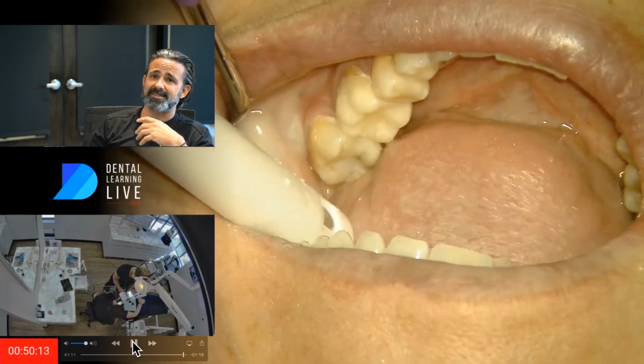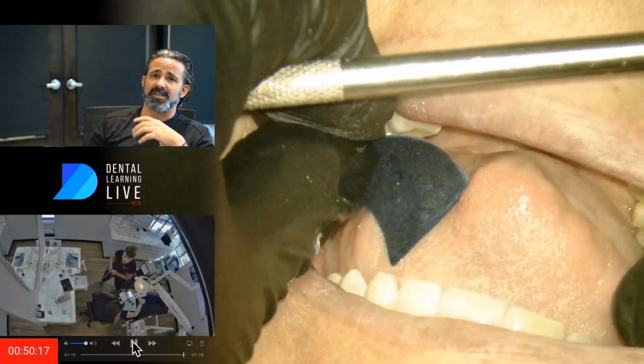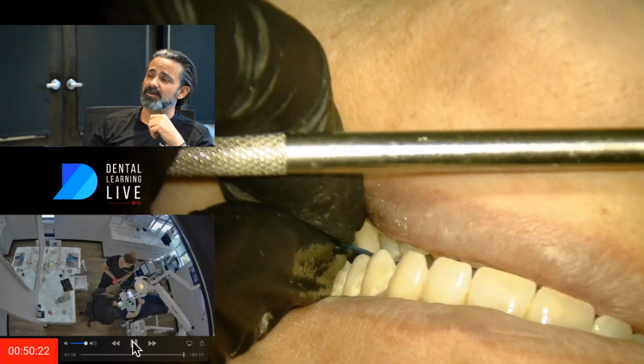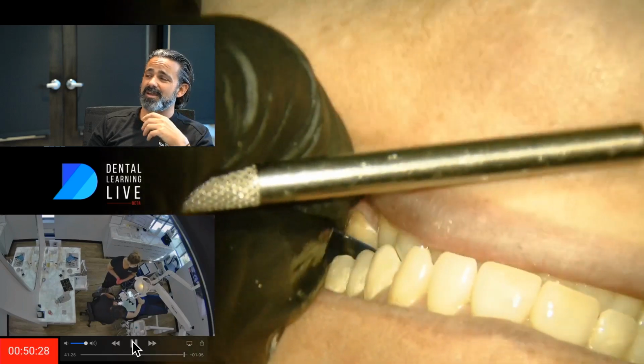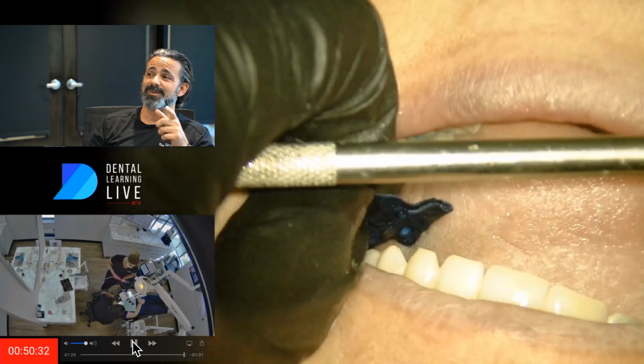And so I like that technique if I'm worried or if I have a very sensitive patient and any level of sensation will freak the patient out. I'll leave it in that case. I don't find that I do it very often, however. It's just there. But if you do that, make sure you take it out.